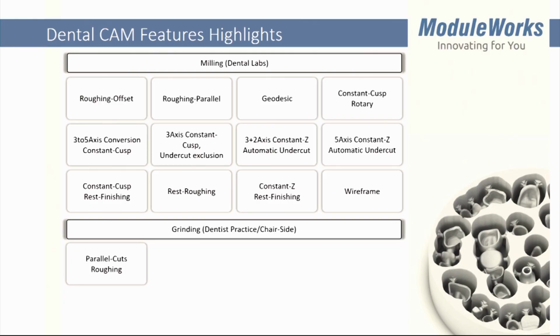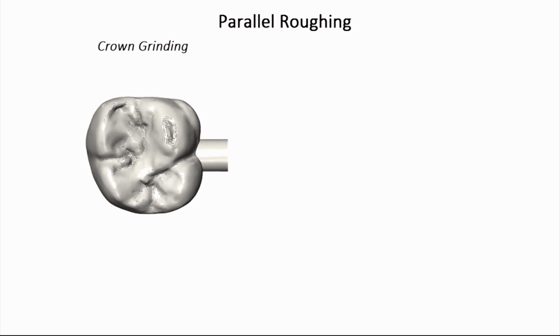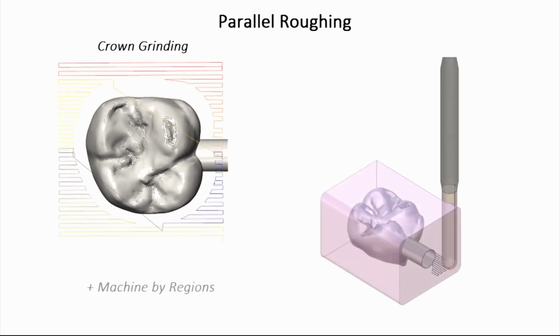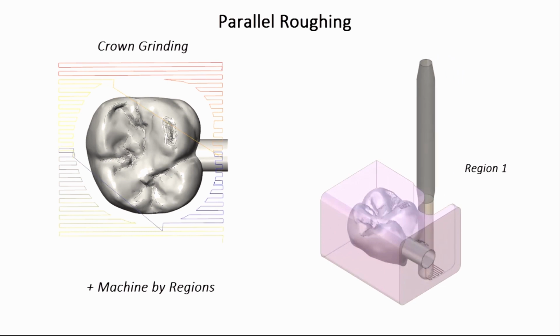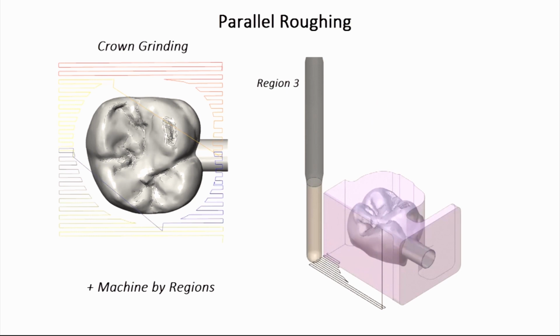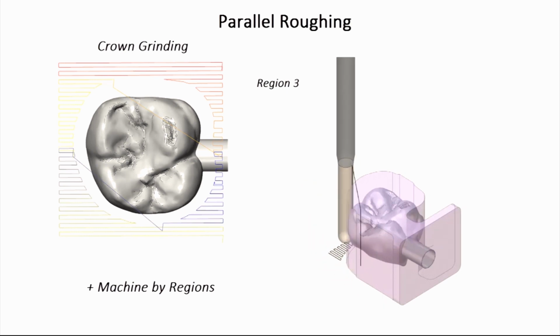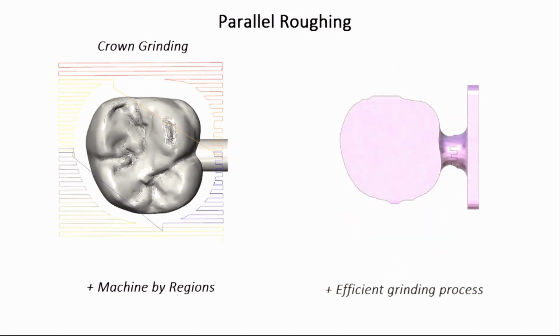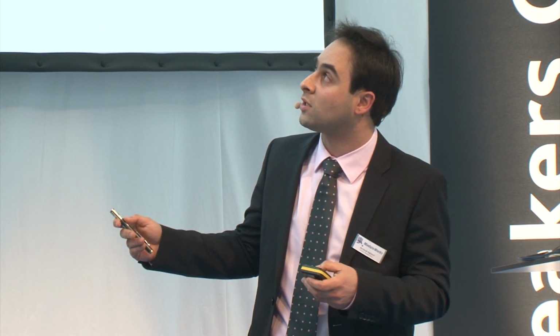Parallel cutting is an easy approach to grind blanks. Here the trick is basically trimming the toolpath against the crown and making the ordering in a way that we create just a minimal number of links, and the ordering is still appropriate for grinding machining. This is a good approach for less complex geometries like crowns.